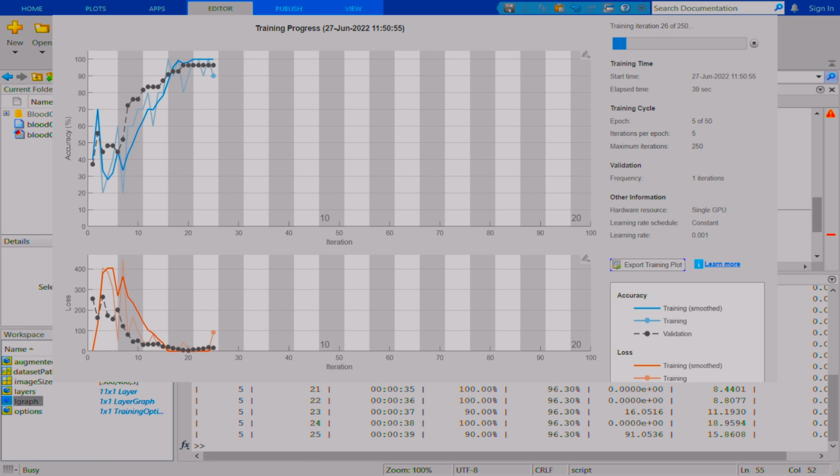Every time it trains, it also performs what is called a validation. So you can see that validation is happening for every training cycle. So you can actually reduce this if you want. You can keep it as 10. So after 10 training sessions, it will do one validation. That's also fine. But if you want to have a better training, you can keep it as 1, 2, or 5 or something. But anyway, according to the number you enter, the time required for the training will vary.